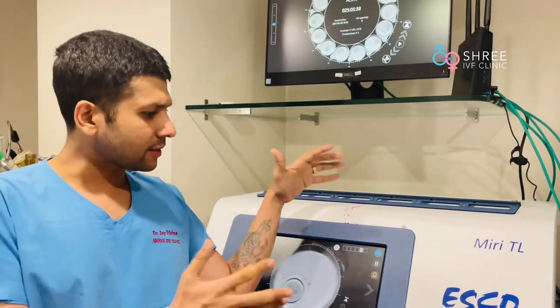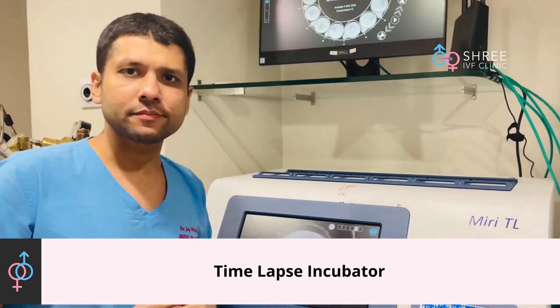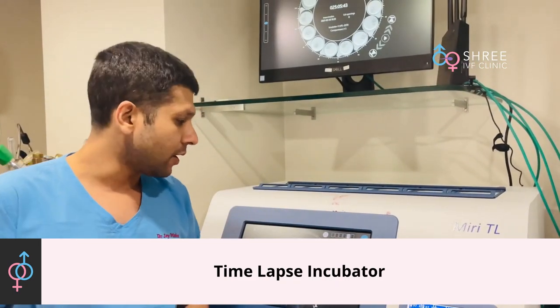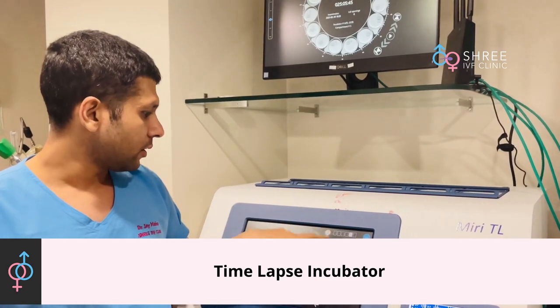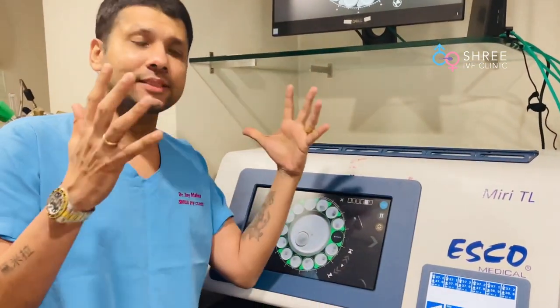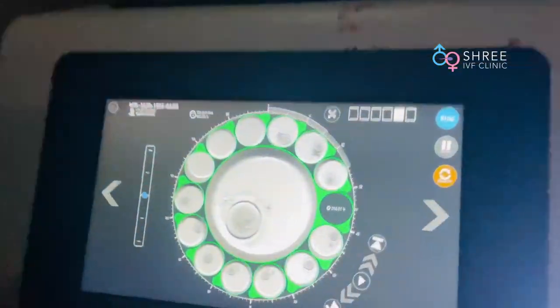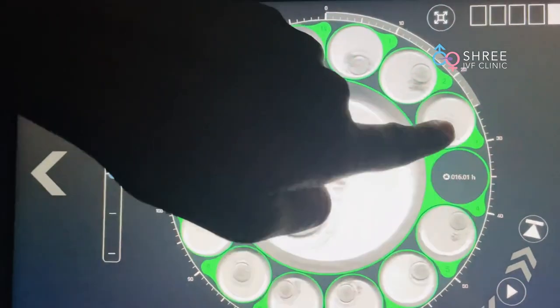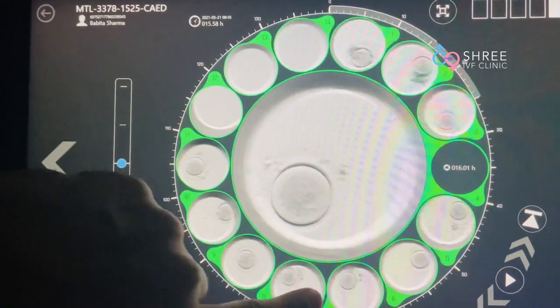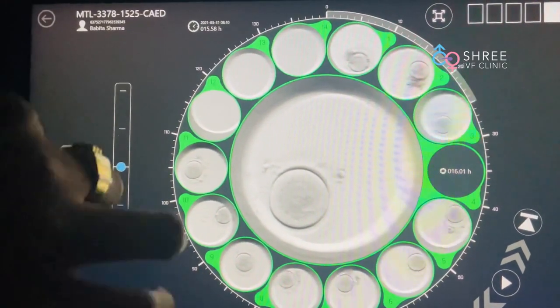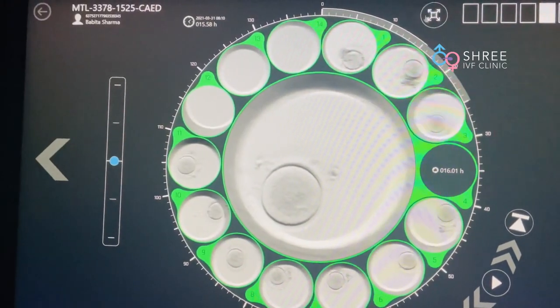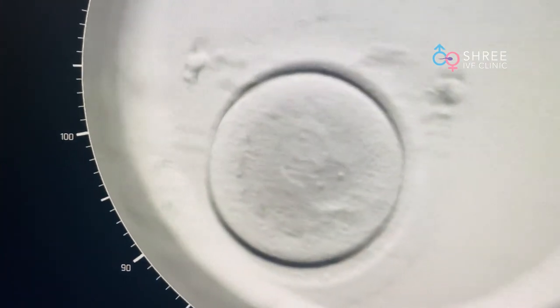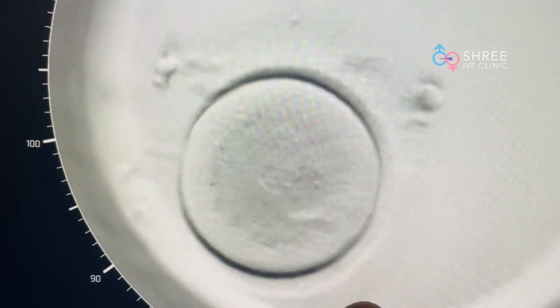This is a time-lapse incubator — a somewhat expensive instrument which allows us to visualize the embryo continuously. If I show you this particular patient, it is best seen with the lights closed. You can see there are multiple eggs kept in a specific chamber, and what we are trying to visualize is the 2PN stage. Let me move the camera a little closer.